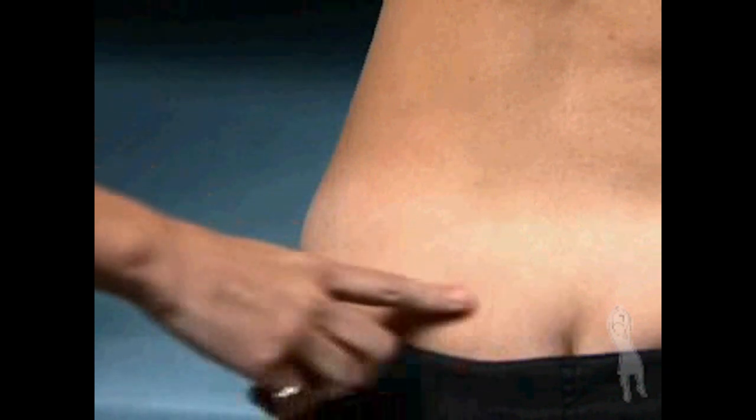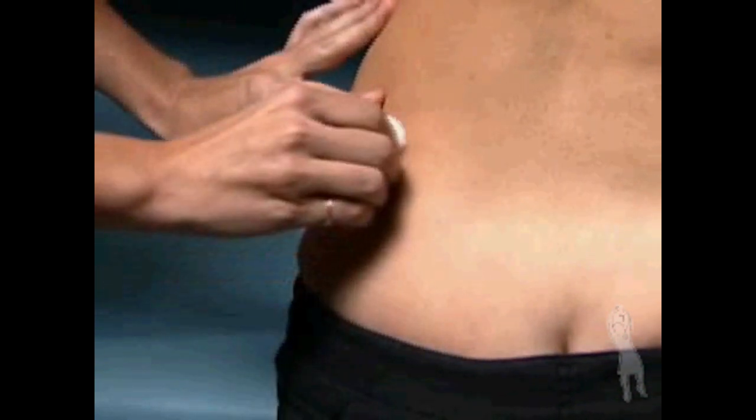For intramuscular injection, choose an injection site as directed by your healthcare provider. The upper outer quadrant of the buttocks will be demonstrated. Alternate sides each day. Clean the injection site with an alcohol wipe and let it air dry.